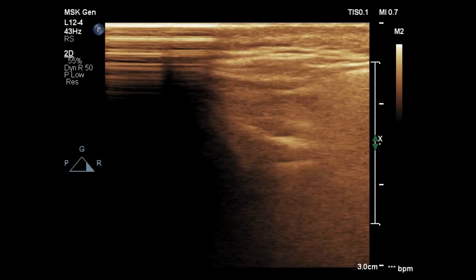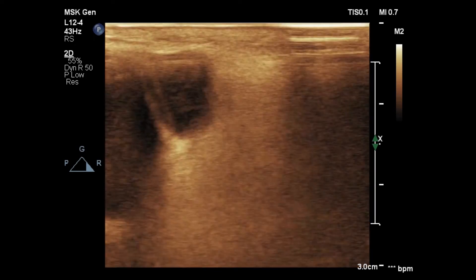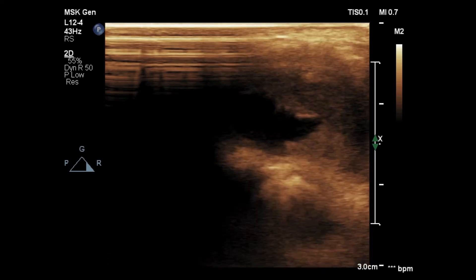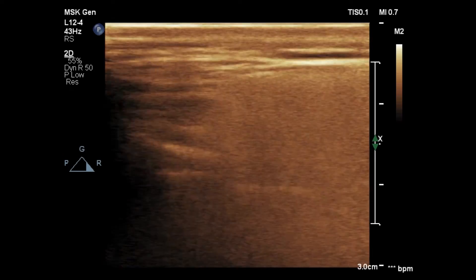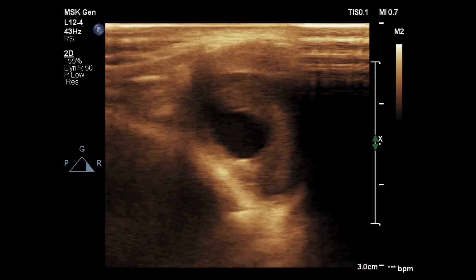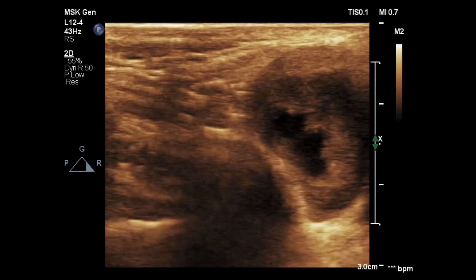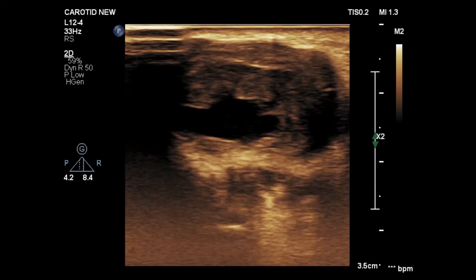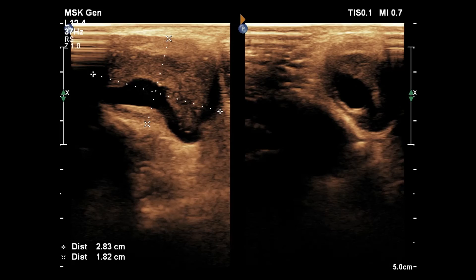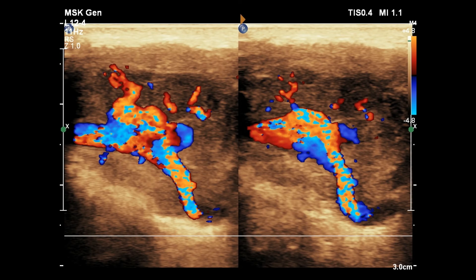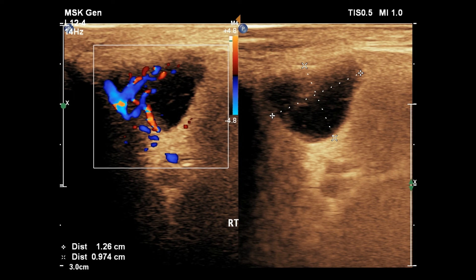Now let's see the masses in real time. When I put the color Doppler on, the superficial temporal artery shows aliasing, suggesting very high flow velocity, which needed further PRF adjustments.